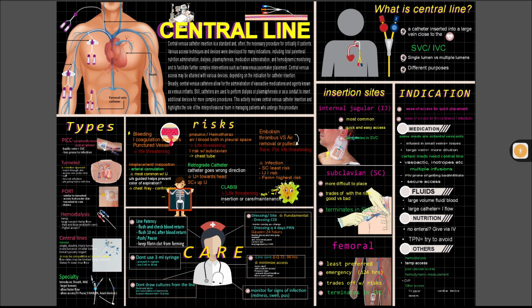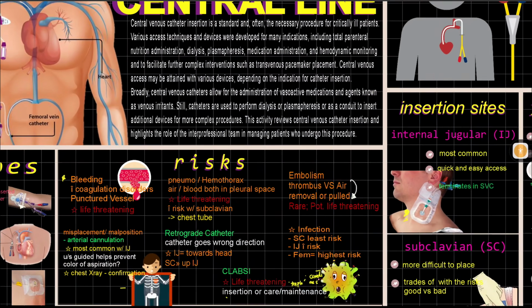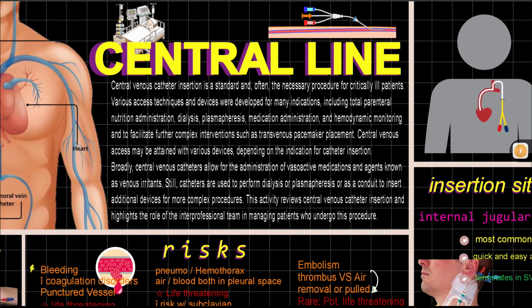Alright everybody, welcome back, and like I promised, today I'm going to teach you everything that you need to know when it comes to your central line. Yes, this is all about your central line. Now, let me proceed with giving you the overview of what a central line is.